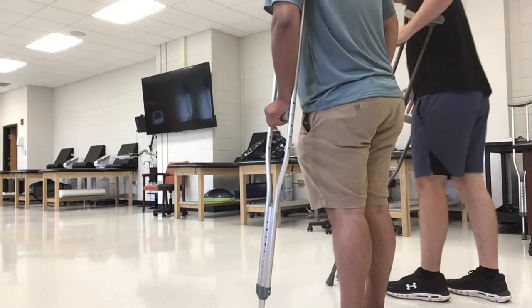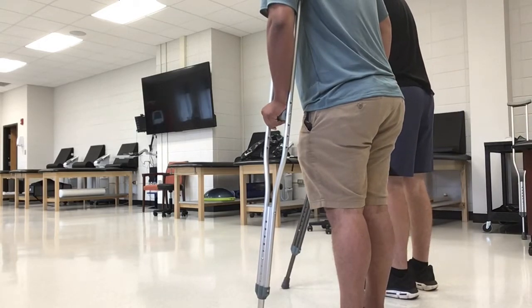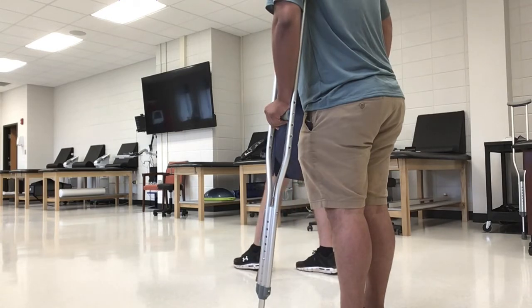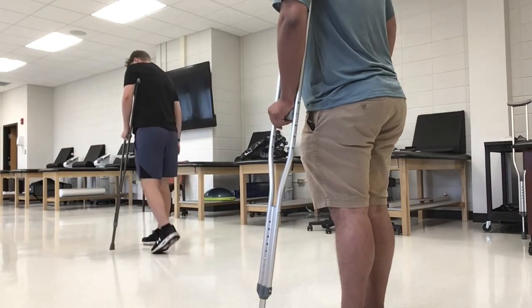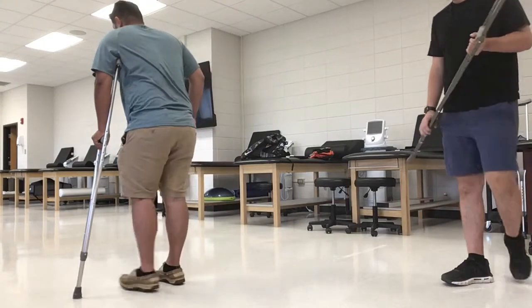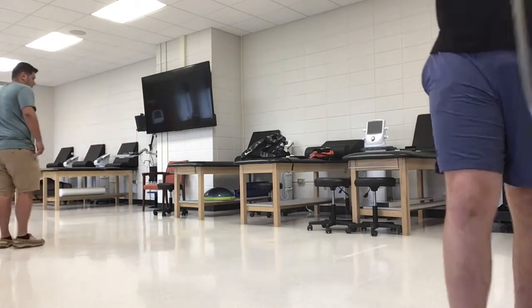So what you're going to do is when you walk, use the crutch and your injured leg at the same time. Okay? So whenever your crutch goes down, you'll put the injured leg down, and then you'll walk through with the non-injured leg. And so it looks relatively like this. Alright, okay, go through. Alright, great job.